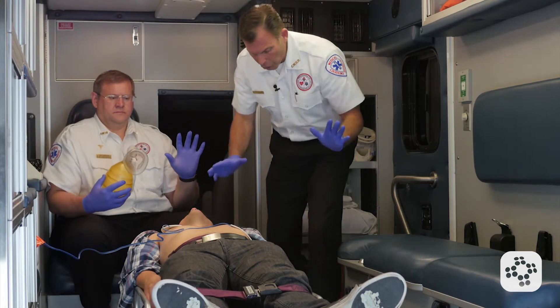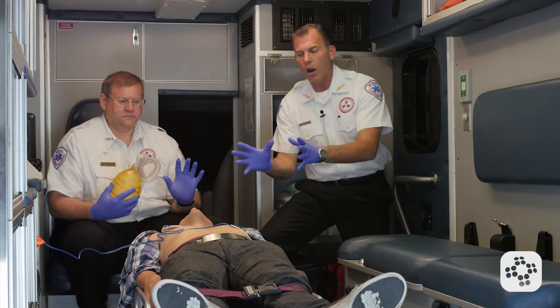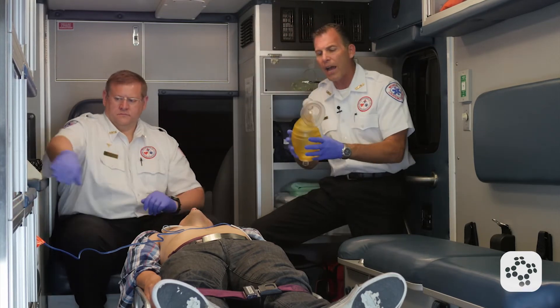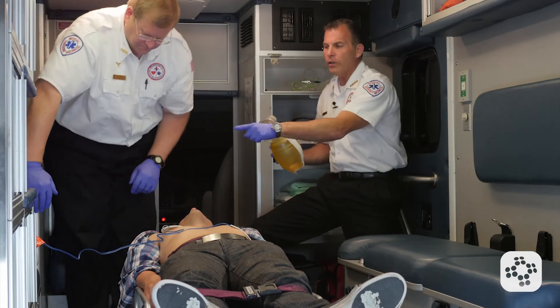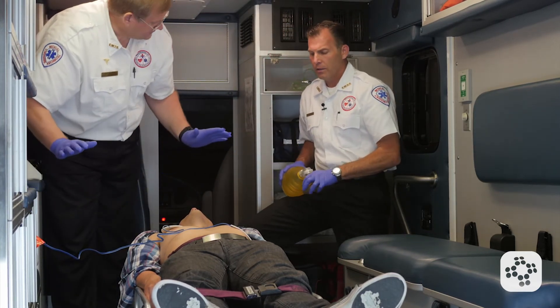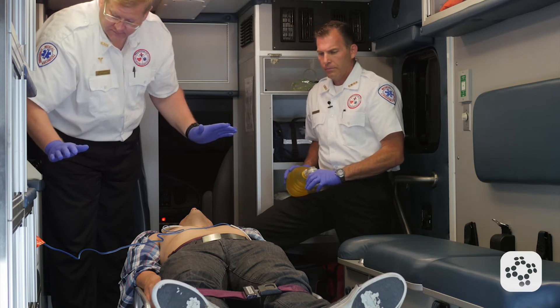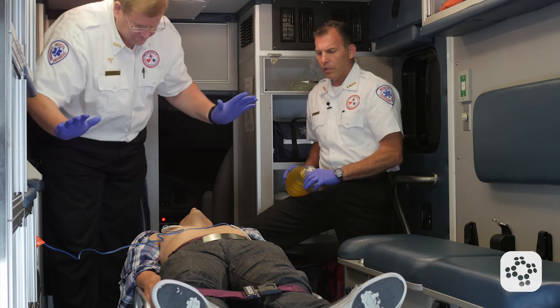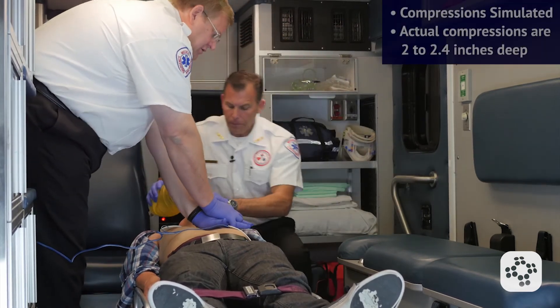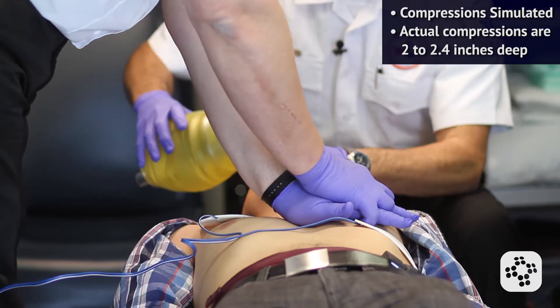Everyone stand clear. During this analyzation of the heart rhythm is a perfect time for me to switch — I'll take over the bag valve mask. My partner is going to go ahead and control the shock. Everyone stand clear. Clear. And he goes right into compressions — one, two, three, four — and I take over with rescue breaths.